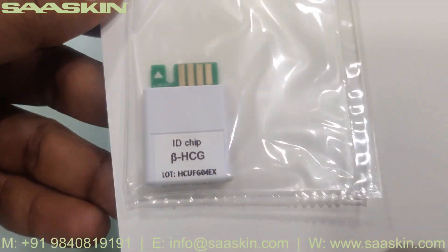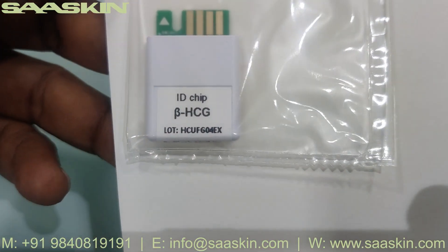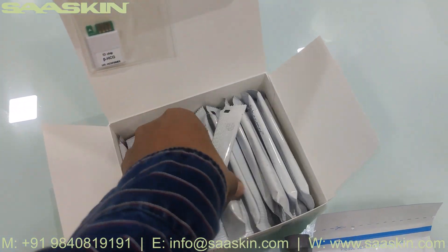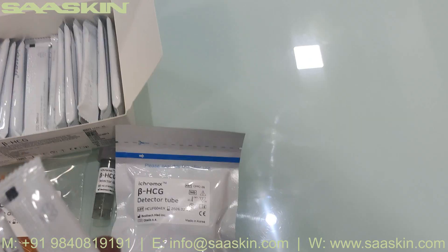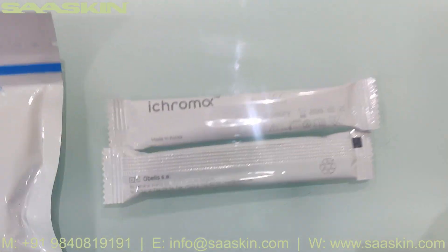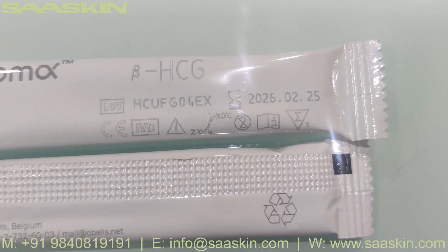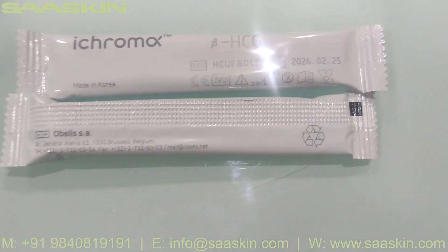Then there is an ID chip which says Beta HCG with the lot number mentioned on it. And then 25 cartridges are here. You can see it says iChroma Beta HCG, and you can see the lot number and also the expiry date here.